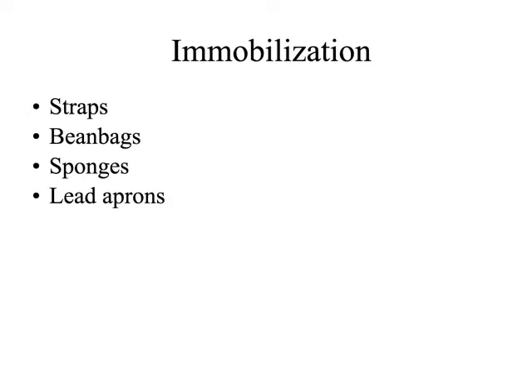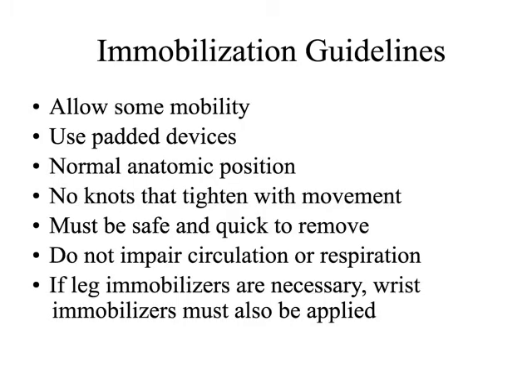The minute you say to your patient, okay, that's it, they're going to jump off the table and bang their head against the gantry and fall on the ground, and they're going to have a class action lawsuit against you, right? So when you come back into the room, the best thing to do is not say anything. They assume that the exam's still going on. Lower the table down, remove the IV, and then say that's it. My tendency is, as soon as I'm done, like, whoa, that's it, I can get this person out of here, right? Unless they're gorked out, just keep it to yourself. Be silently satisfied.